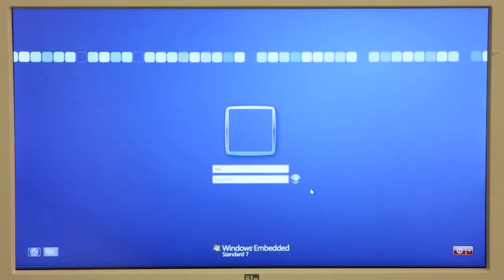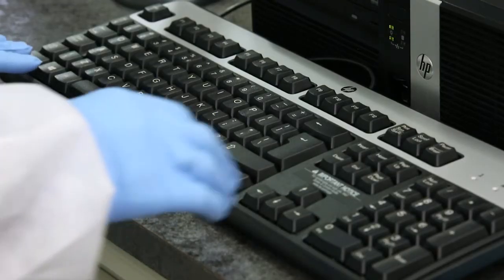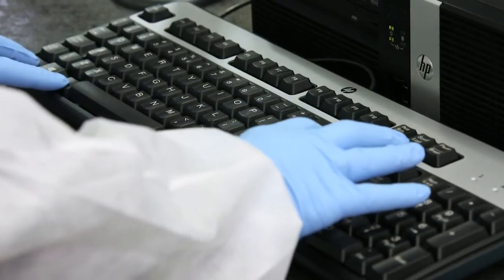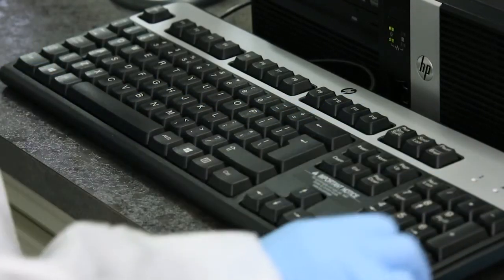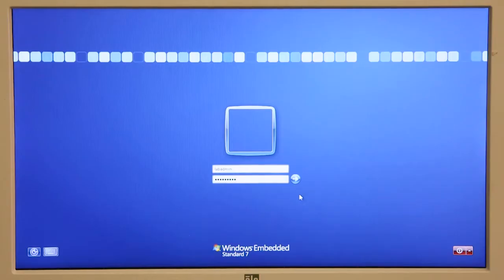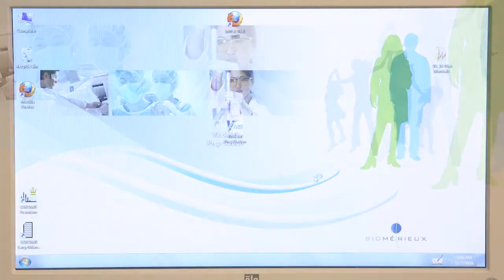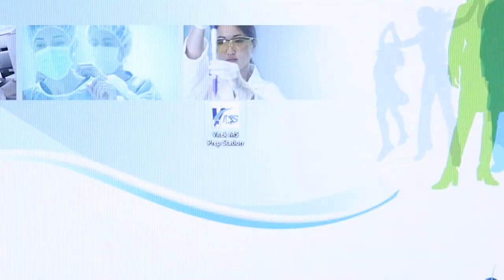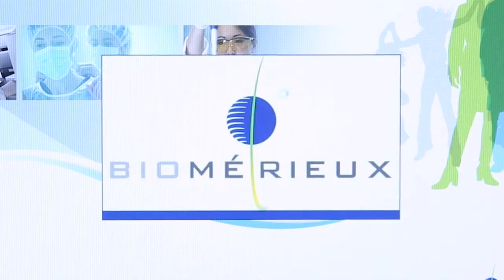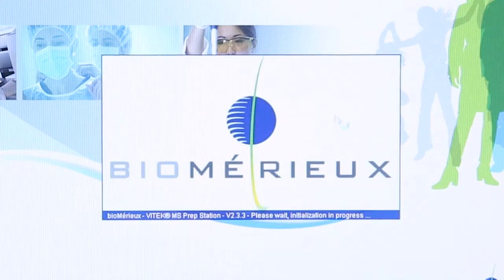If necessary, log in to Windows on the PC by pressing Control-Alt-Delete on the keyboard and entering a Windows username and password. On the Windows desktop, double-click the Vitec MS PrepStation icon to launch the software.